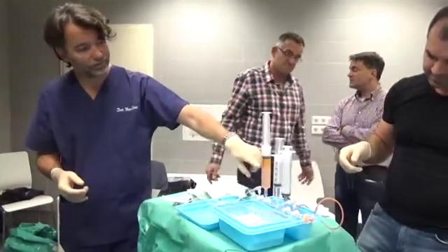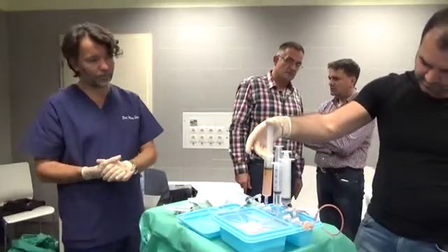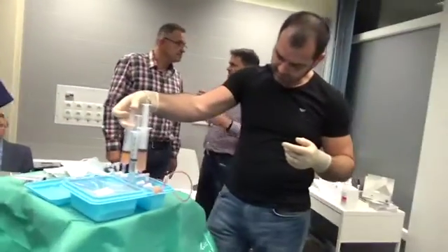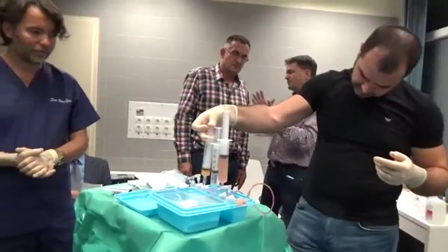So it's transparent — water. Push out the water. If you will do an error now, you push all the fat on the other syringe — no problem, we will come back and do the same thing. It's not like that. It's ok. Perfect.